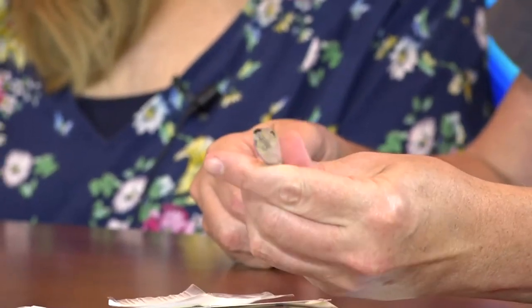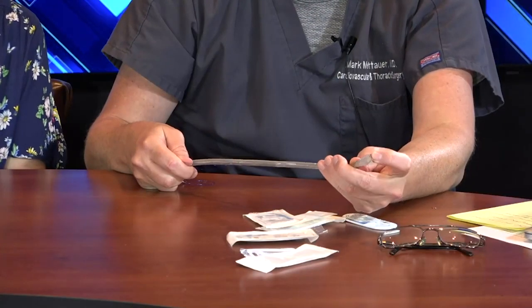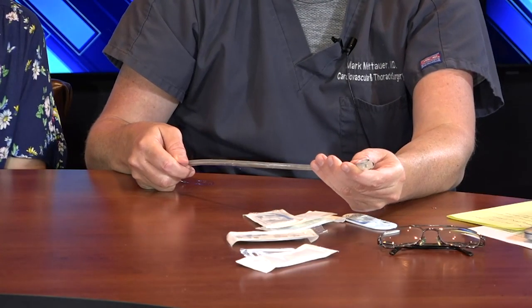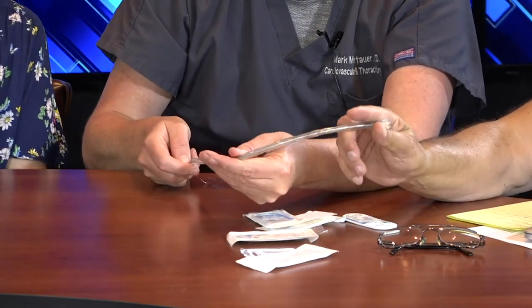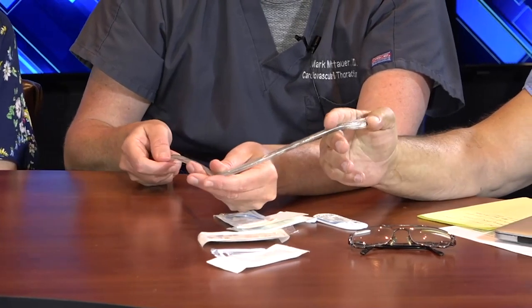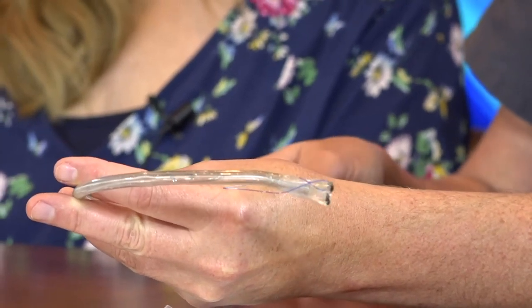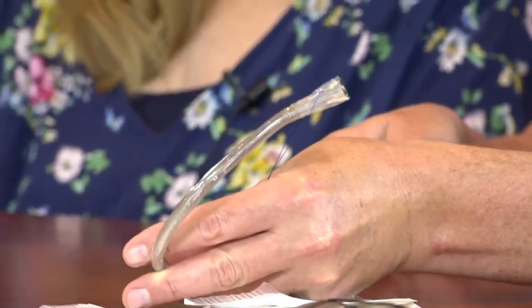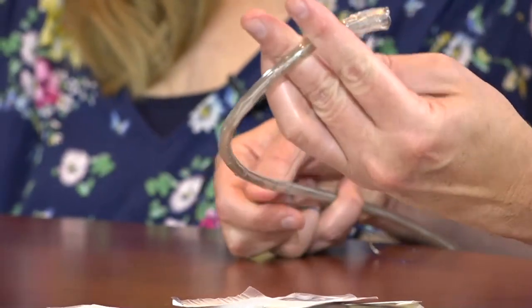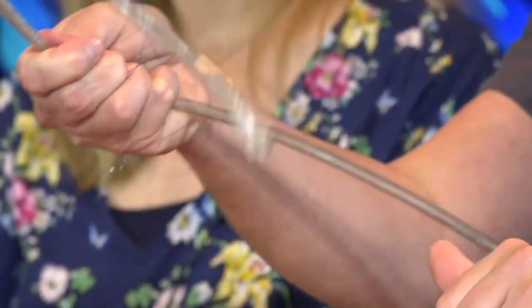Again, as we showed in the second video, the meat and potatoes is inside here and can get the clot. The flower or the pedals is just kind of an added nice little version there. So I think that's what creates essentially the funnel. Right, it draws in, it gets the flow to be directional, a vortex, with little pieces and so on. So this little technique makes it steerable. Makes it a steerable catheter. And it's just a simple modification that doesn't require a patent change.